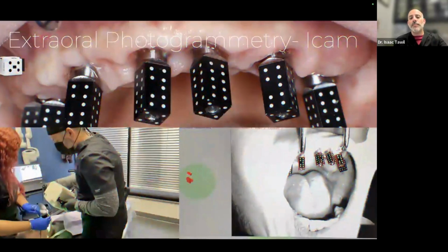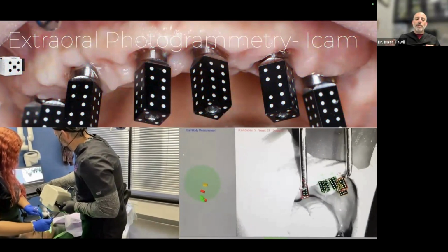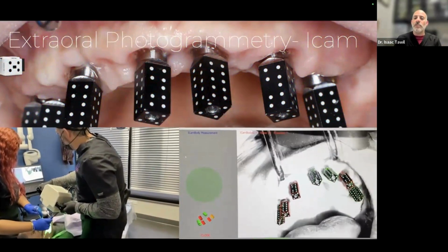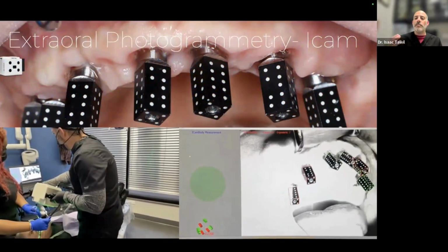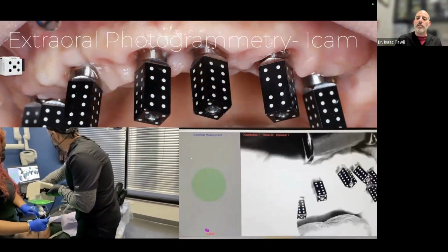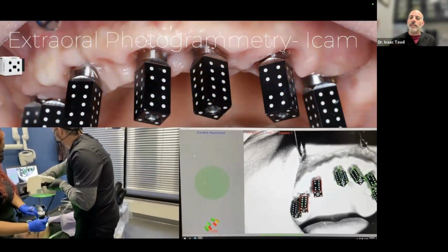So with the photogrammetry here, as we're capturing, you can see here we're on the extraoral positioning, and we're getting that known data. It will turn green once you know that you are successful. In other systems, it'll make a noise or a ding, and now you'll be able to overlap. But sometimes I have some trouble capturing that back implant you see on the left side, on the bottom right, but on the left of it. It's hard to align all that data together.